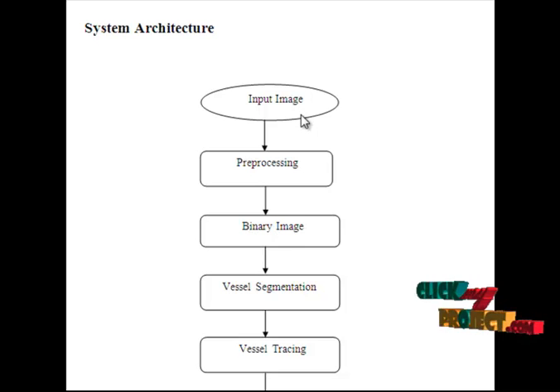Here we have to provide a retinal image as an input. The provided input image is passed through the pre-processing. In pre-processing, here we have to separate the color channel from the original image. The green color band was used in the analysis since it shows the best contrast between the vessels and the background retina. The gray levels were normalized by stretching the image contrast to cover the full pixel dynamic range, excluding the surrounding dark border pixels and any image labels.